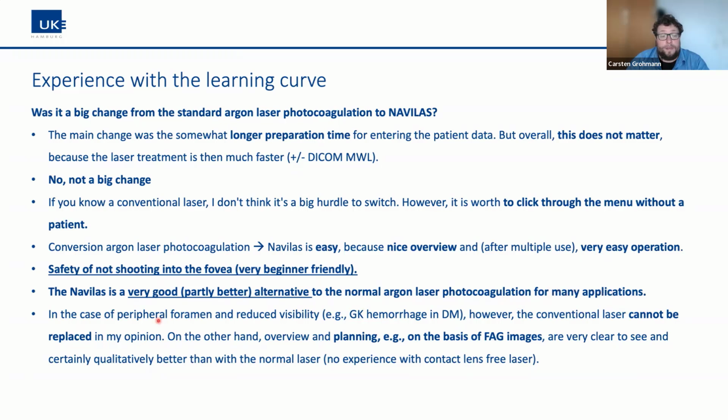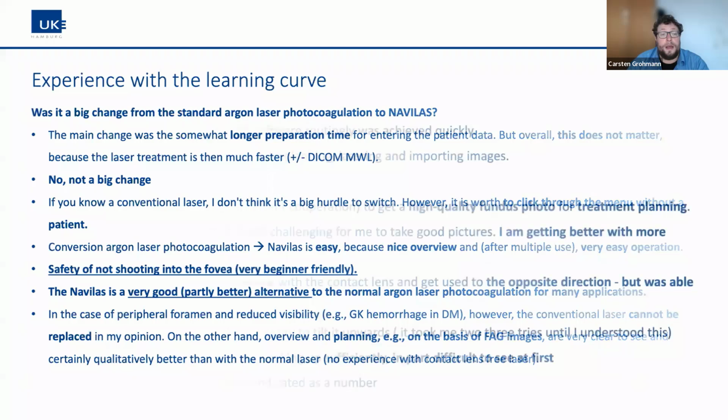But there are also some opinions about reduced visibility of hemorrhage in the vitreous. The conventional laser cannot be replaced, in my opinion. We also still have the conventional laser there for sophisticated treatments, and also to have another laser with another wavelength here. I think it's good for the hospital.